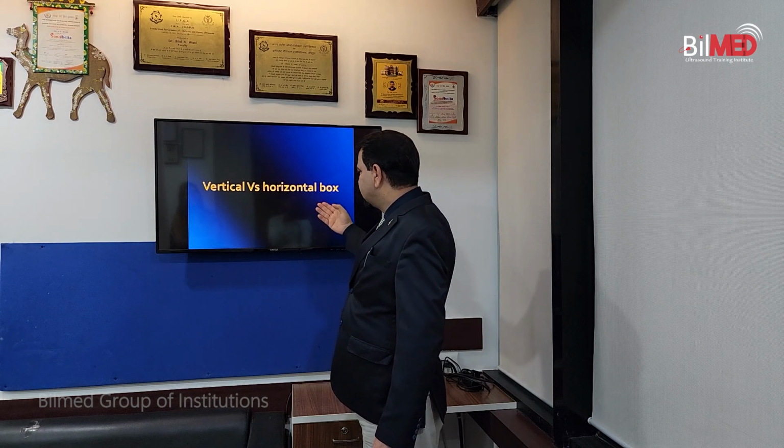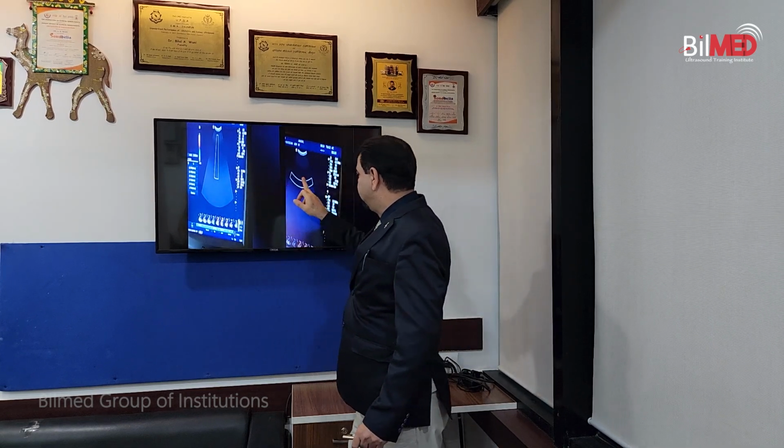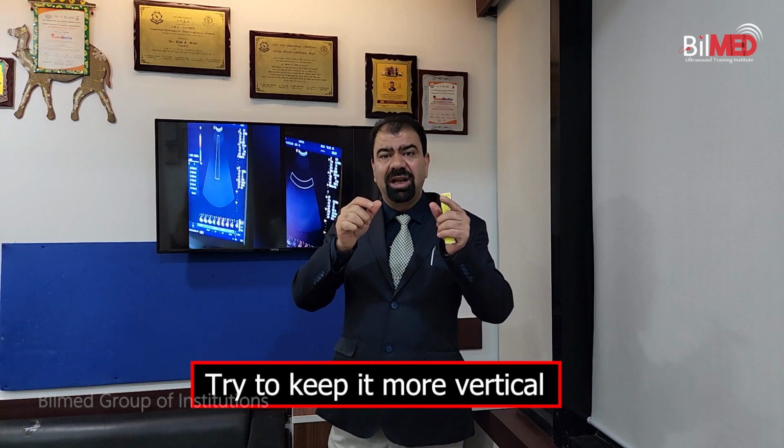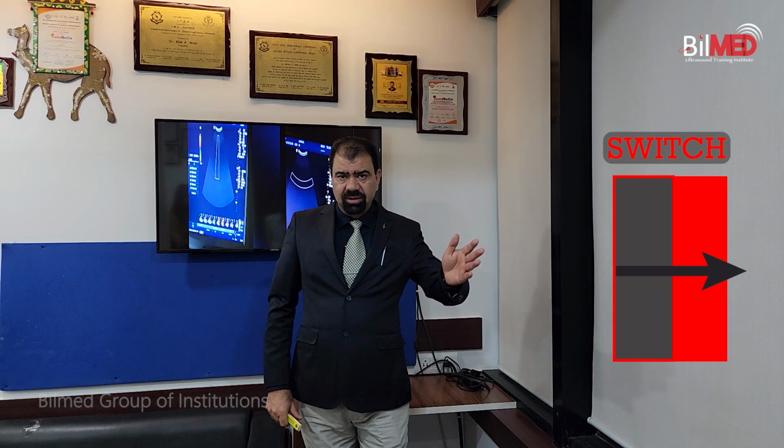Then one more important point is whether the color box should be more vertical or more horizontal. If your color box is more vertical, as you see over here, this will increase the frame rate as compared to a horizontal color box. So don't keep your box horizontal; try to keep it more vertical, because the more vertical it is, the higher the frame rate of the machine. These are the very basic 2 to 3 points by which you can improve the image quality when shifting from grayscale to color Doppler. By just pressing the color button, you will not get the flow, but by understanding what to do, you will do wonders with color Doppler.